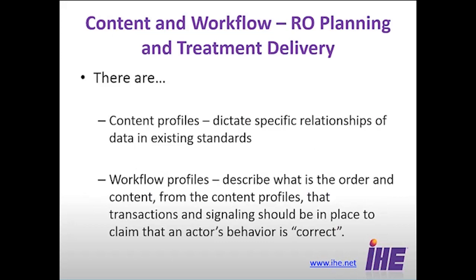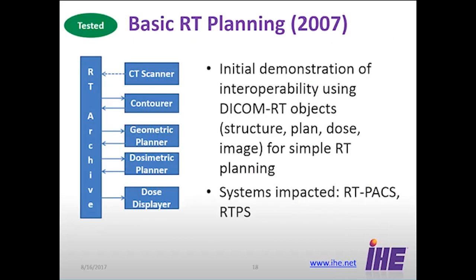We have content profiles and workflow profiles. Content profiles talk about the specific data items, and workflow, again, is, as you would imagine, the order and flow of the information to make sure that things happen at the proper time.